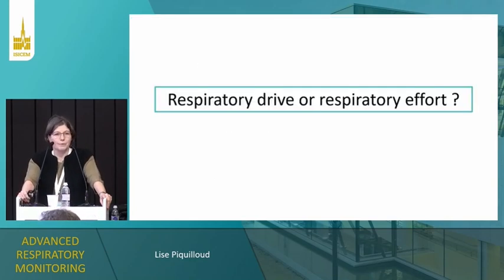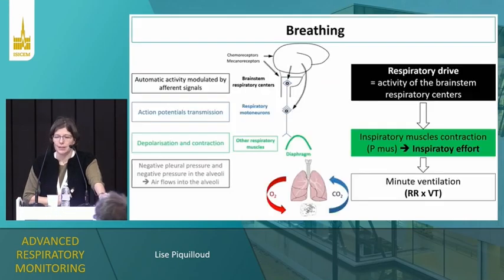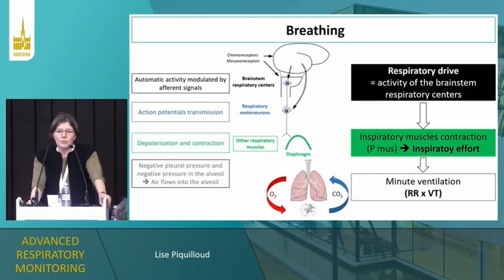And the first thing I would like to discuss with you is, do we monitor respiratory drive or respiratory effort? Because the difference is important. To answer this question, it's important to understand that drive and effort can be related, of course, but are not always the same and do not always give the same information.